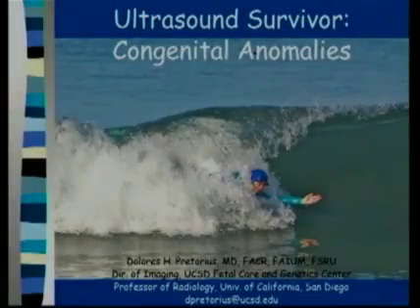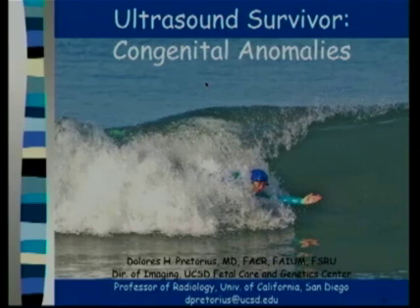My name's Dr. Pretorius. I'm going to talk to you about this little talk I made called Ultrasound Survivor, Congenital Anomalies. Basically, it's a little talk that I've made for you to look at two pictures and see if one of them's better than the other and whether you'd like to be that one, based on all these reality television shows.